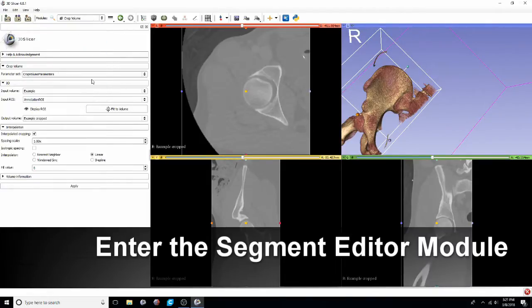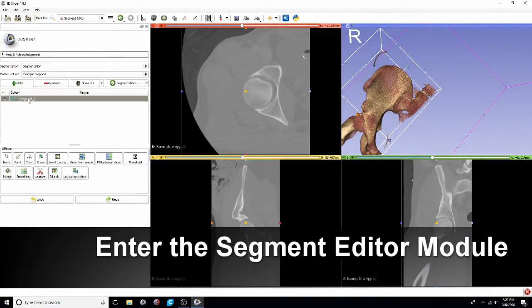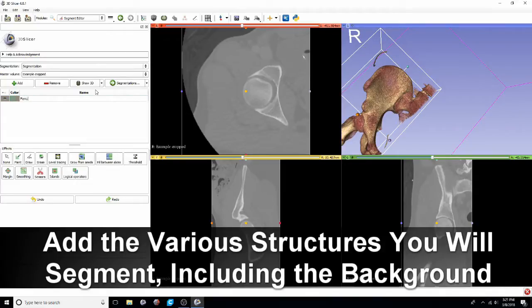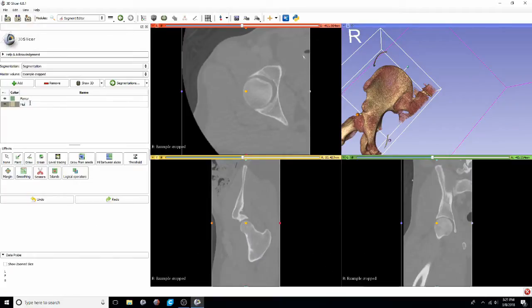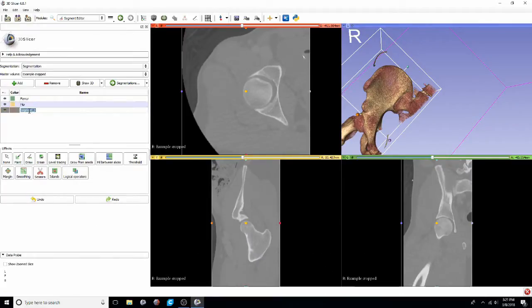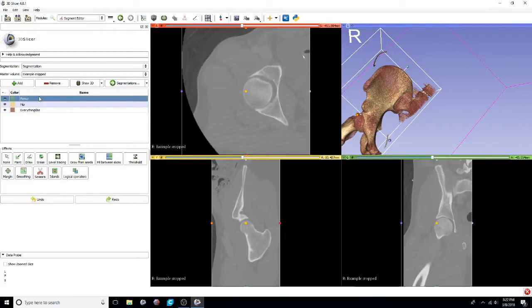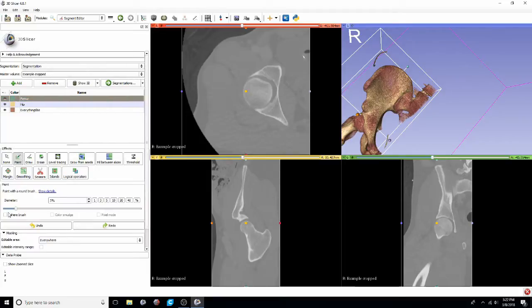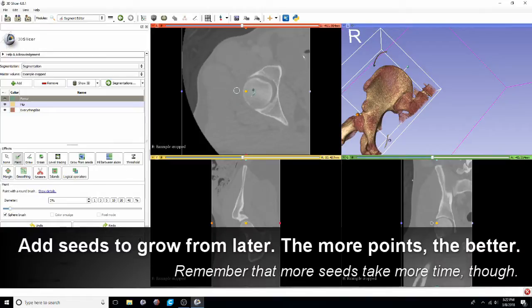Next, we'll open up the segment editor and begin to add the segments that we ultimately want to have. For this video we'll be segmenting out the femur, the hip, and then you'll want to include a label or a segment that is absolutely everything else in the model. First, we'll go to the paint tool. Make sure that the diameter is one that's appropriate for the windows we're looking at.